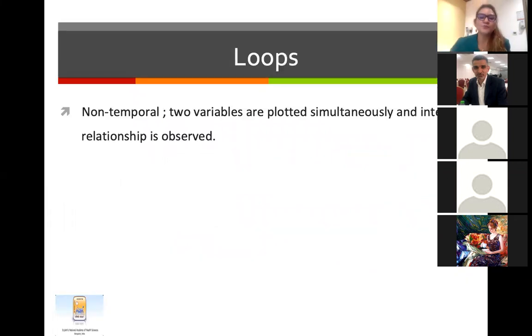So loops are when two variables are plotted simultaneously and you look at their interrelationship.